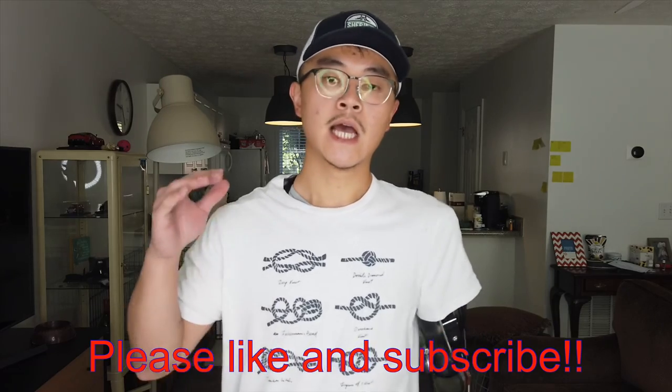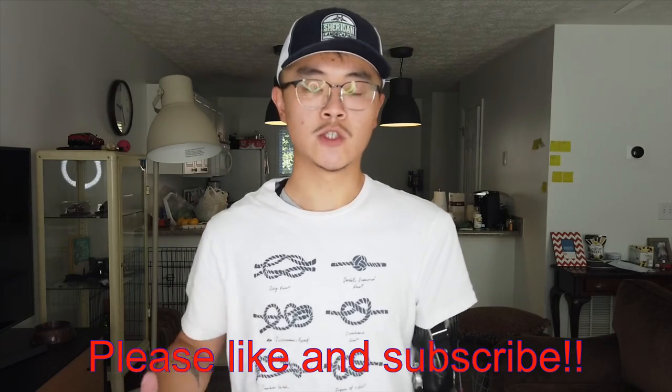Well, thank you so much for watching. I hope you enjoyed the content today and got to see how my above elbow prosthetic arm works and how I personally like to put it on. Please let me know if there are any other contents that interest you or any questions.